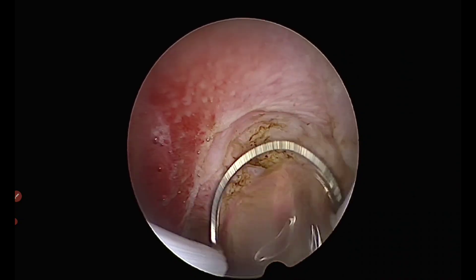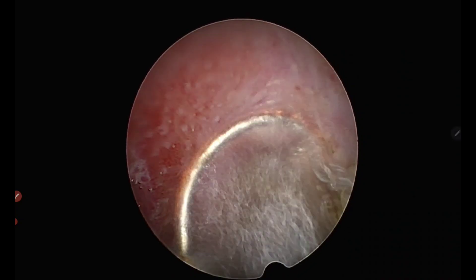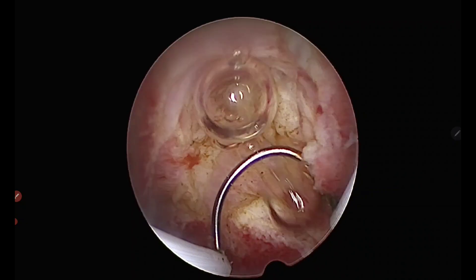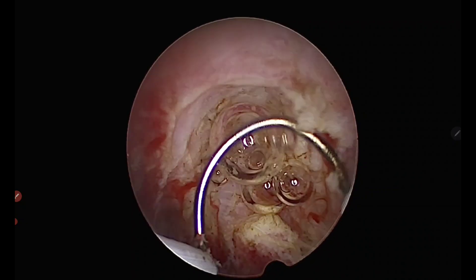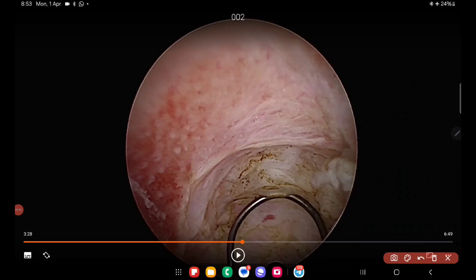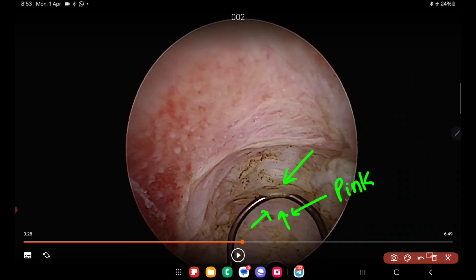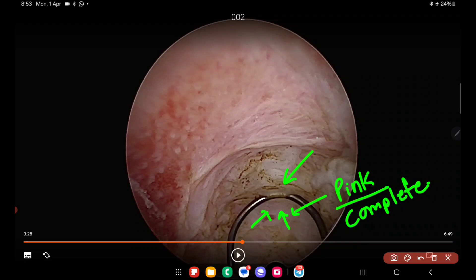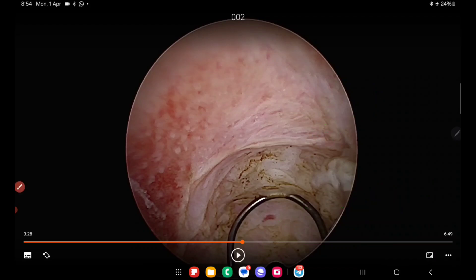The loop is now comfortably placed behind the fibroid, and you can see the pinkish myometrium coming up behind it. Behind the air bubble is the fibroid, and behind the fibroid is the brownish fibroid tissue — but closely you will see pinkish myometrium appearing. This pink myometrium confirms that a complete job has been done and there will be no residual fibroid. The complete myometrium visible behind the fibroid signifies that all of the fibroid has been removed.